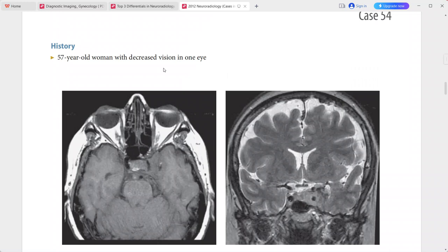Differentials include nerve sheath tumor, pituitary adenoma, chordoma or chondrosarcoma, metastasis, sarcoidosis or other granulomatous process, and Tolosa-Hunt syndrome.